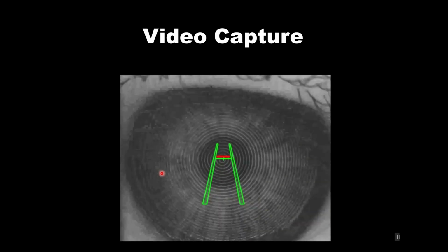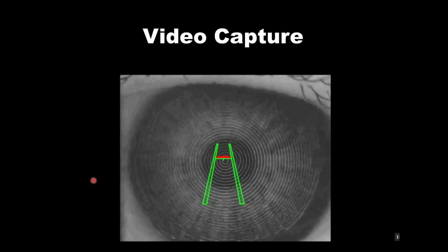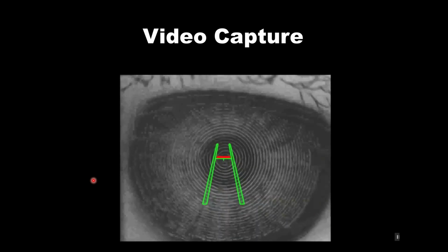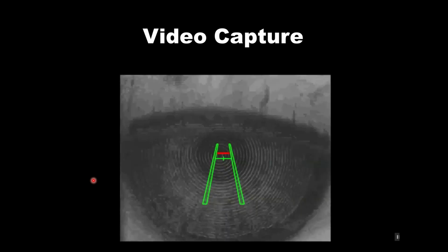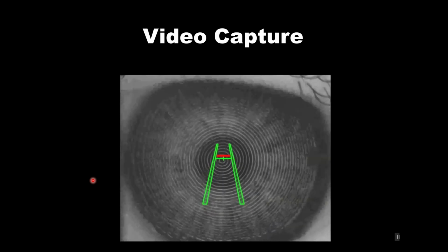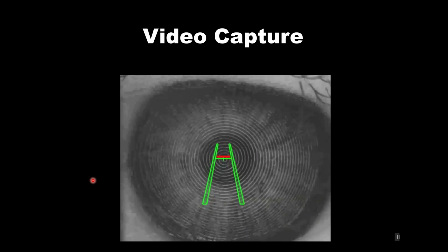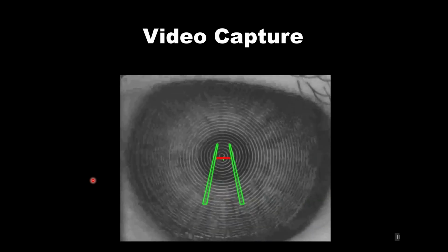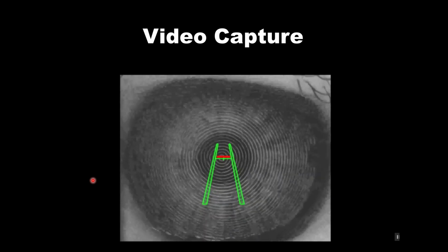And that's because this patient is incredibly dry-eyed. And so the instrument can't reflect the rings off nice, smooth tear film, and so you get this poor reflection. And that can help us to understand whether we have tear film breakup and what severity that we have for dry eye.